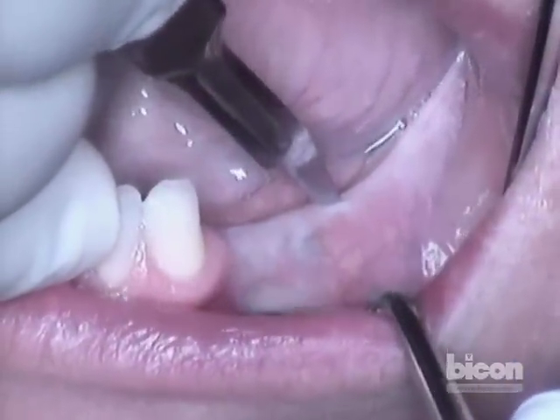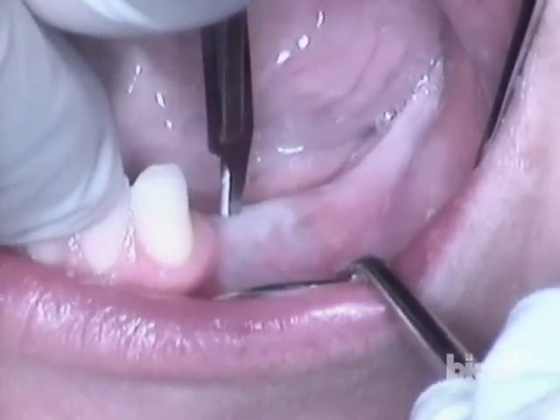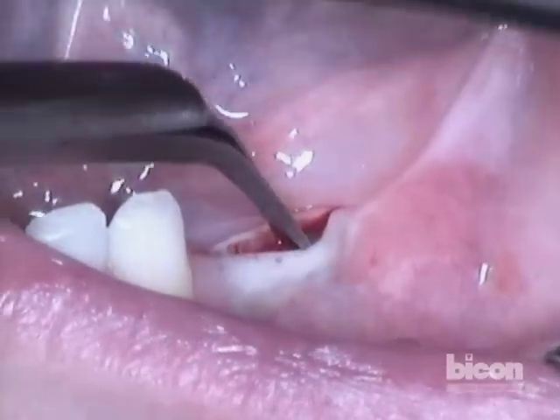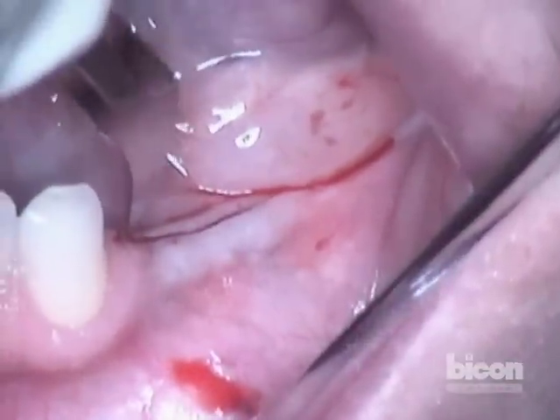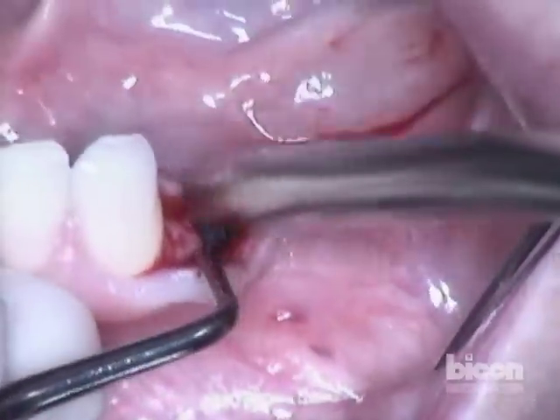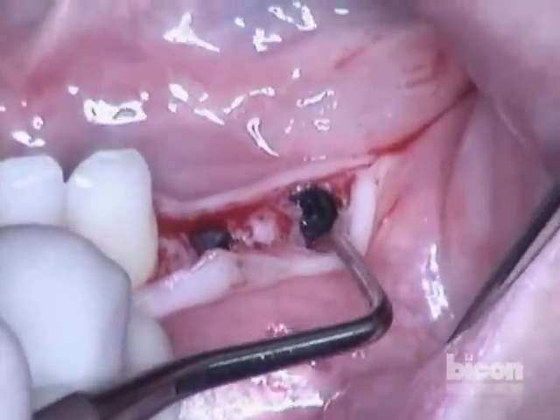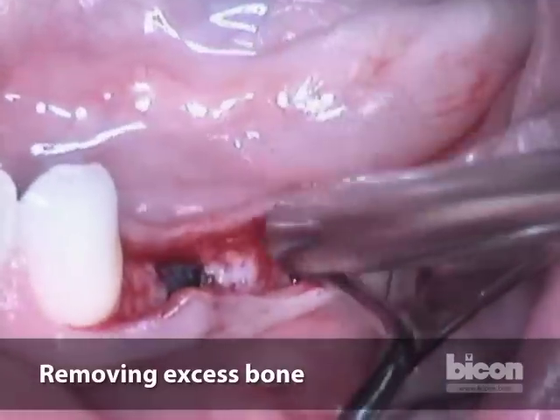I will try to avoid a complete severing of the attached gingiva right at the neck of the adjacent cuspid. Here is the top — looking good. Just come right up, hugging the distal surface of this tooth. We now see the top of this implant and the top of the other implant, and we see that there is bone all around. We will just remove a little bit of that excess bone.